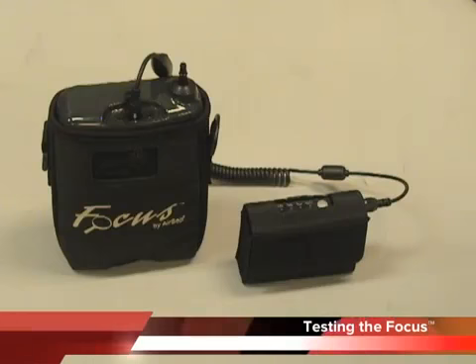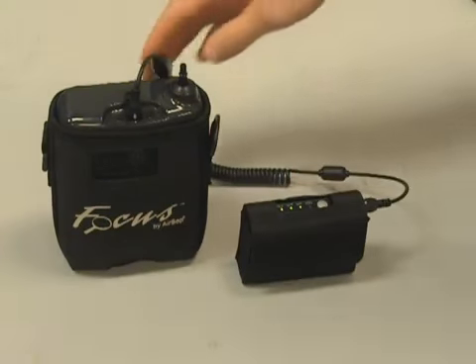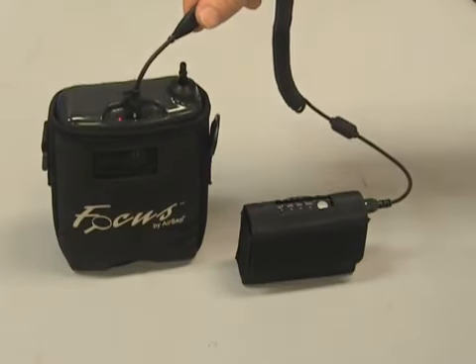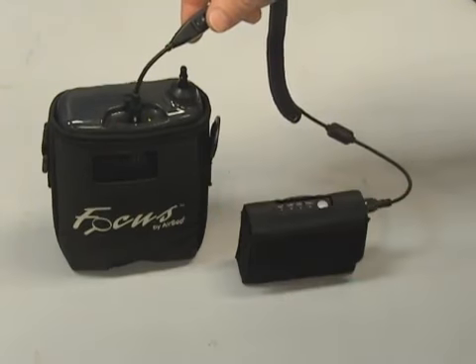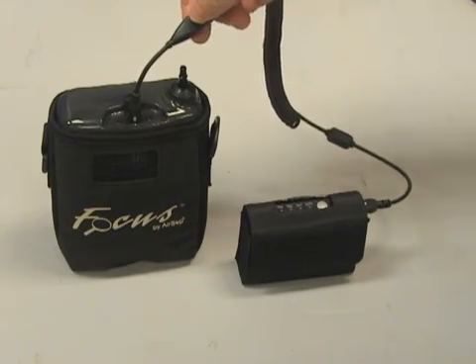To get the Focus into test mode, simply put power to the unit. With your coil cord, turn power on. Let the unit warm up for 10 seconds. During the warm-up period, the LEDs will flash alternately. Once warmed up, the green light will stay lit. Within 2 seconds, turn off and then turn on and off 3 times.